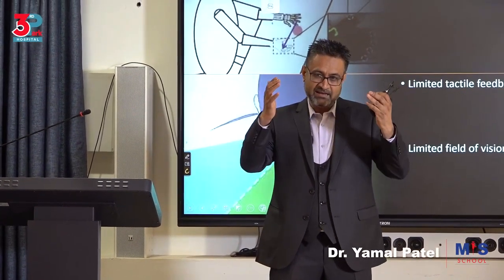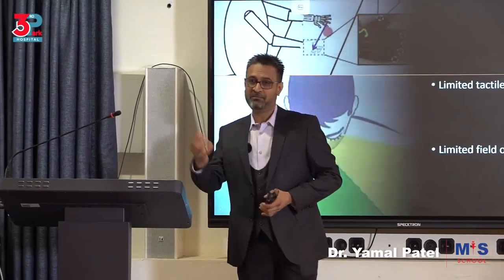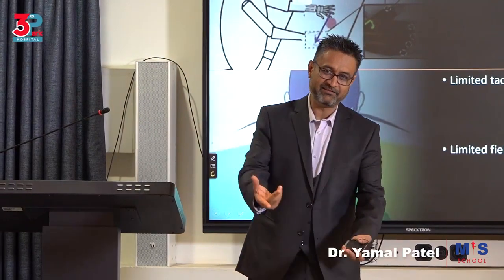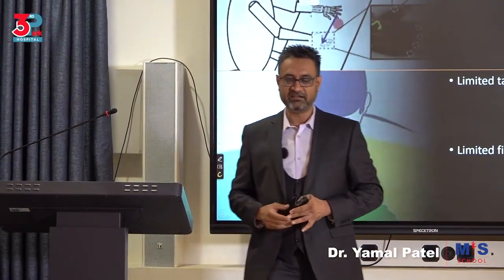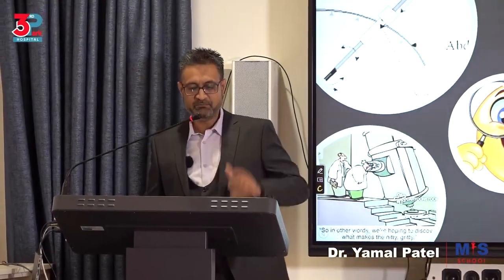Unless you have pre-planned and mapped it, you may not know where it is. So in an open surgery, you'll palpate the uterus and say, I feel something here. Make a cut and remove it. You need to plan differently for MIS. So these few things should be important.